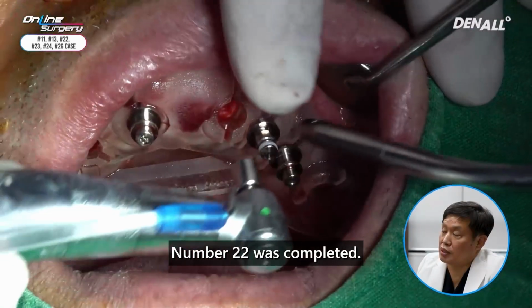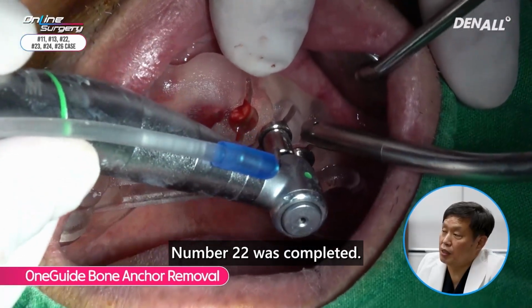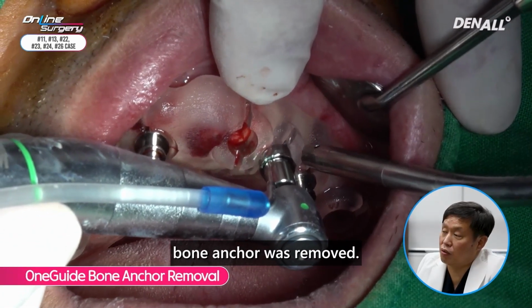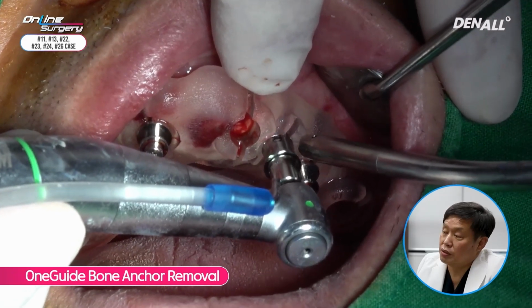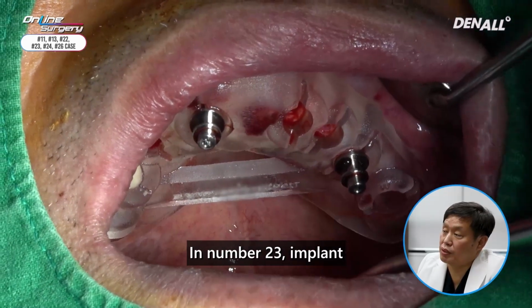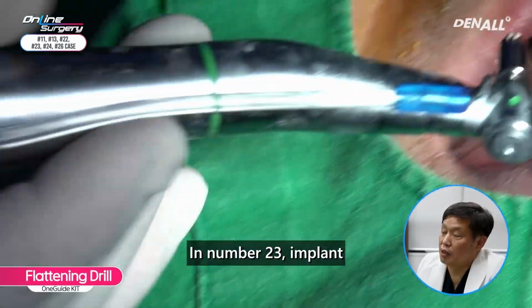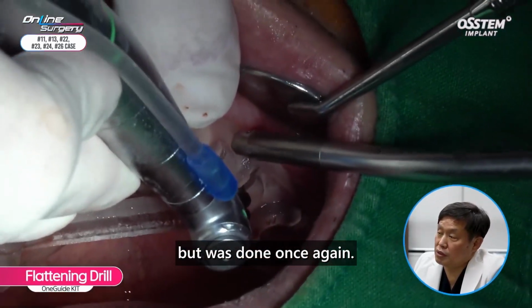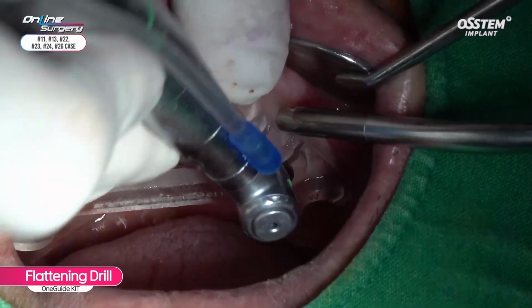Number 22 was completed. Moving on to number 23, bone anchor was removed. In number 23, implant placement preparations were conducted. Flattening drill was done before, but was done once again.